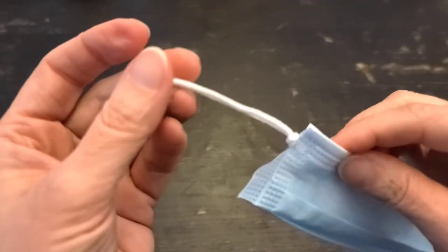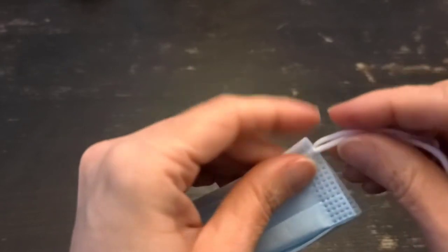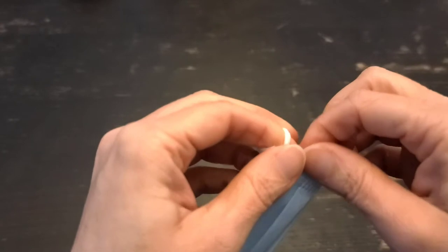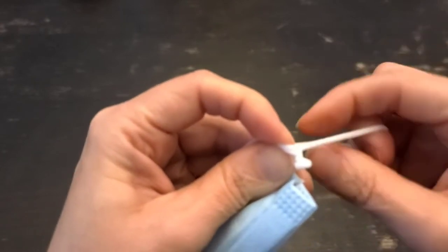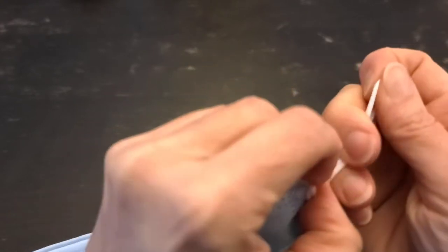See how that's right up against the mask? Then we're going to do the same thing on the other side — slide it up tight.